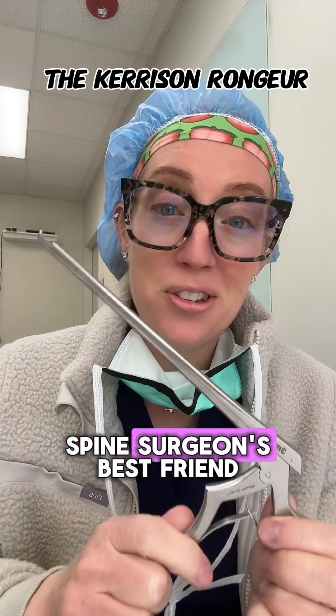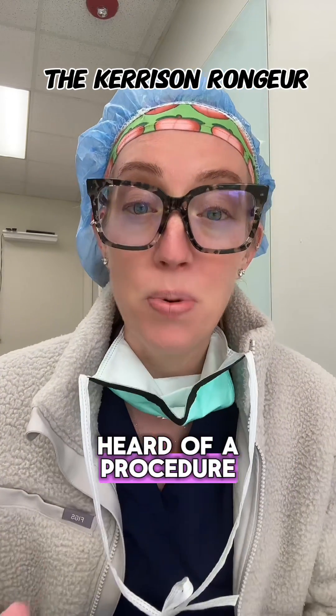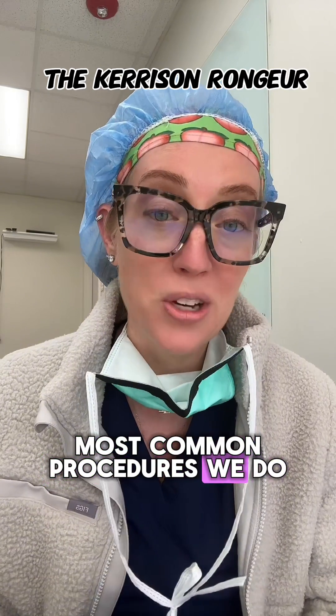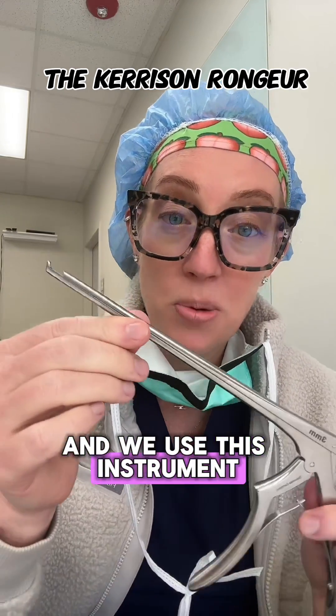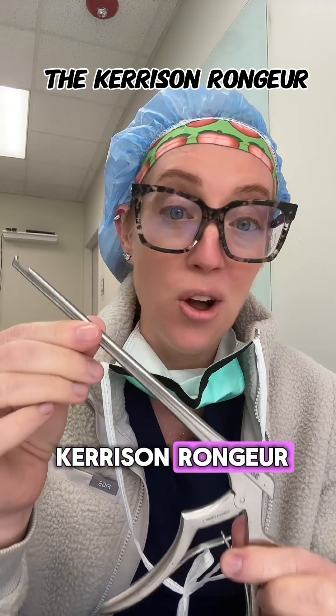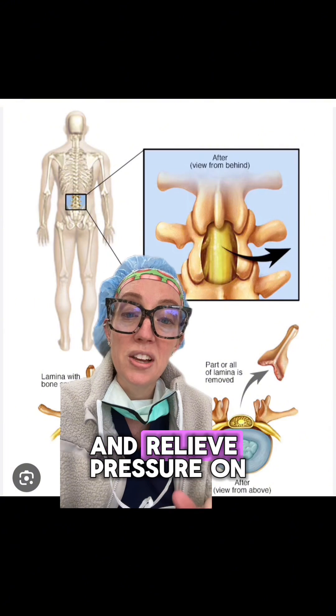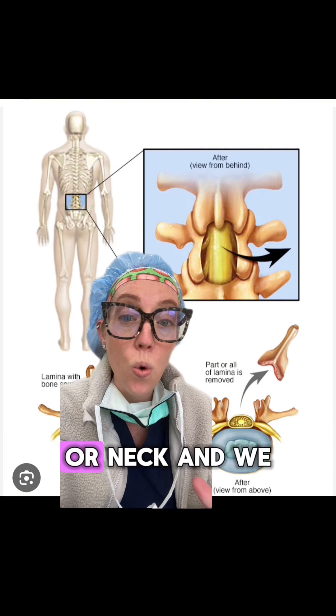This instrument is a spine surgeon's best friend. If you've ever heard of a procedure called a laminectomy, it's one of the most common procedures we do, and we use this instrument which is called a Kerrison rongeur. A laminectomy is a procedure where we go in and relieve pressure on the nerves in the back or neck.